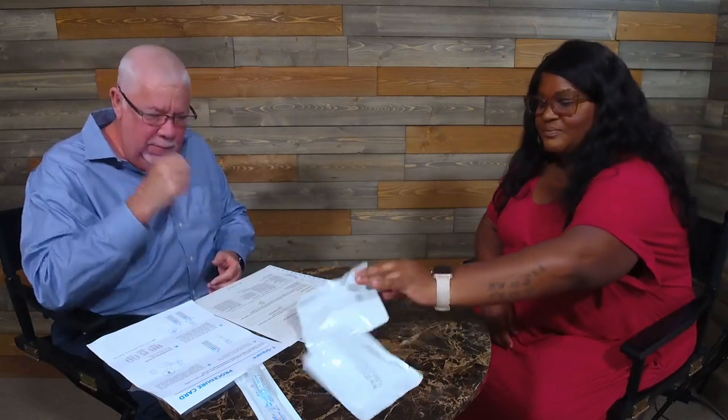So let's go through the demonstration. I have Shar, my donor, with me. Welcome, Shar. Thank you, Joe. So Shar, we're here for your drug test, and it's going to be an oral fluid drug test, so we don't have to empty pockets or do any of that. Sounds good. You did wash your hands on the way in, so I appreciate that. You can go ahead and pick an oral fluid device.